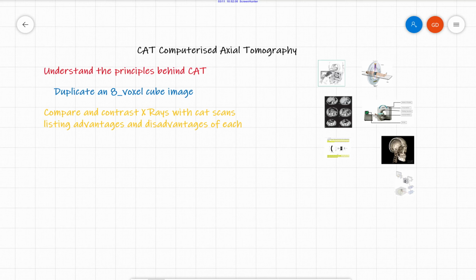After we finish talking about the X-ray machine, the X-ray provides us with two-dimensional images. We will see today that the CT scan or the CAT provides us with more detailed images, or three-dimensional images. These images help us to know more about the details of the internal structure and the organs, the depth, the dimensions of the organs of the human body. So in short, it shows more details than the usual 2D X-ray machine.